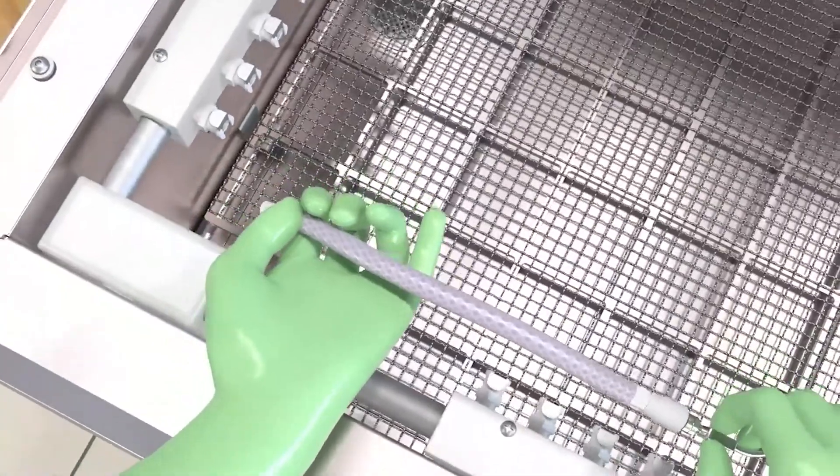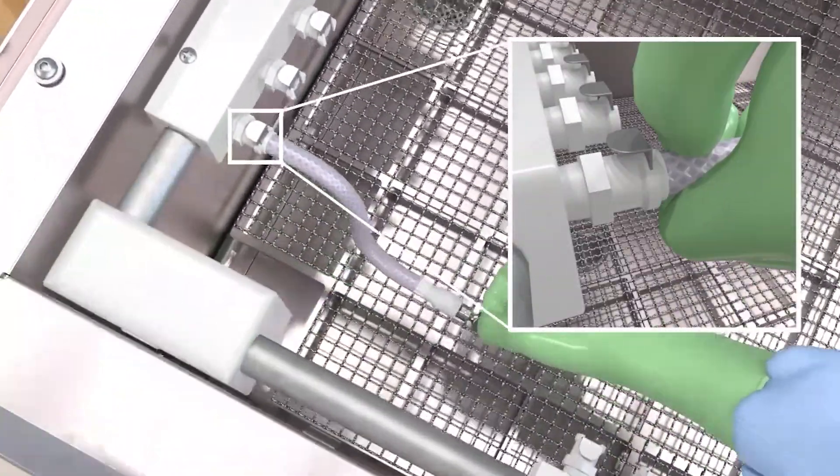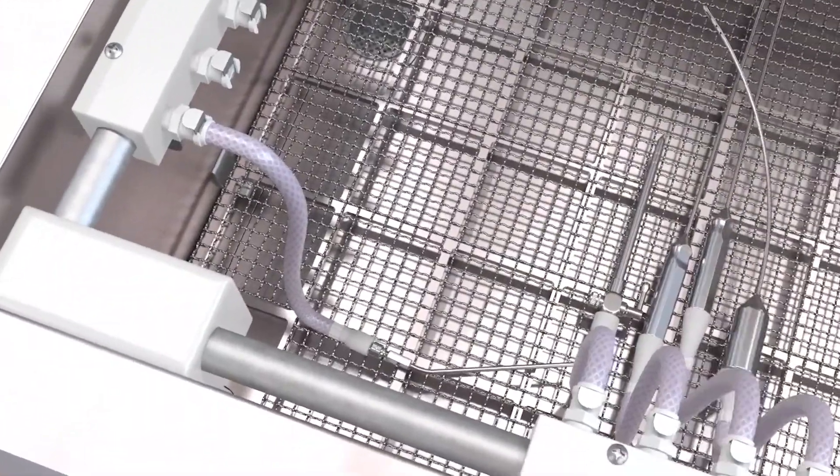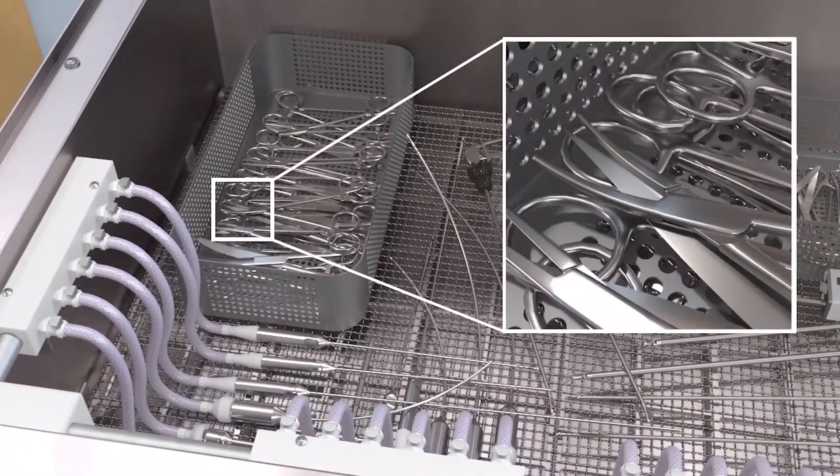First, each cannulated instrument is attached to one of 24 specialized ports. Non-cannulated instruments can be placed freely in the trays, in the open position.